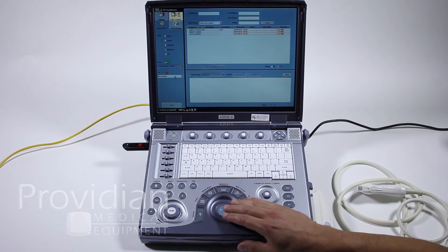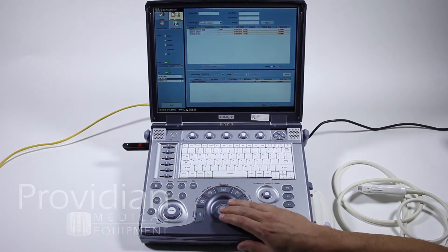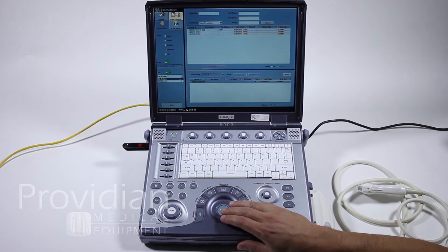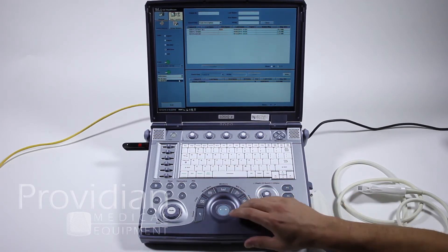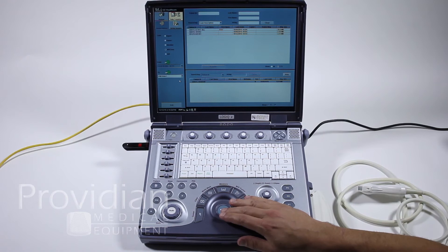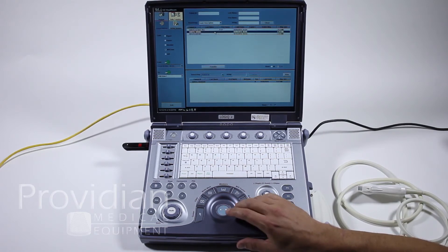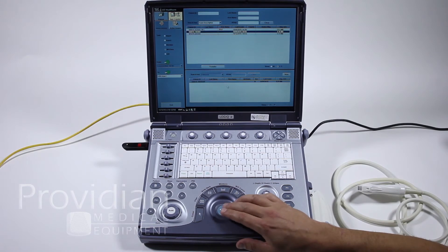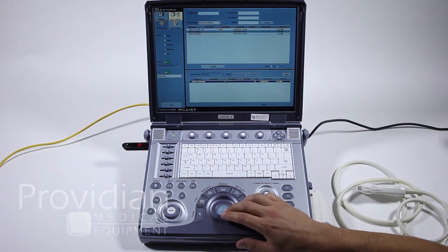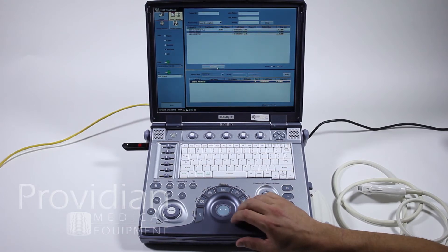You can export them to JPEG or some other format from there. Right now, let's show you how to do it to a USB. I've chosen MPEG view. Down here, it's very important, and this is what's confusing. It will usually go to no archive and will not let you export. I'm going to choose this USB drive. I just stuck it in there and didn't notice it immediately. Here are previous exams I've taken, and here's the current exam. I can choose this.